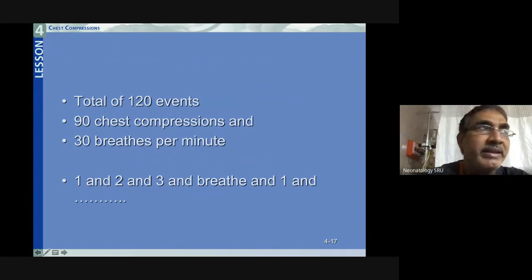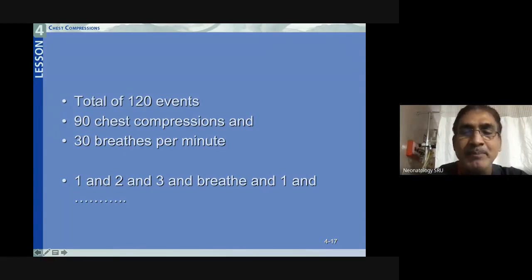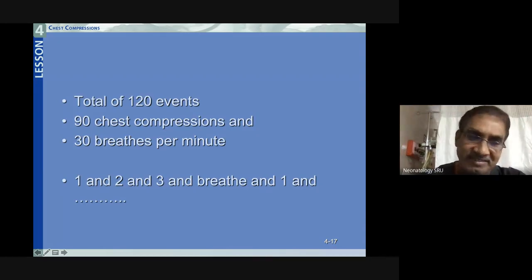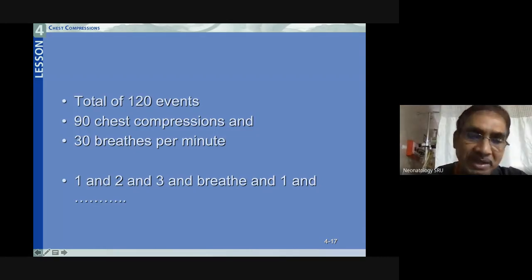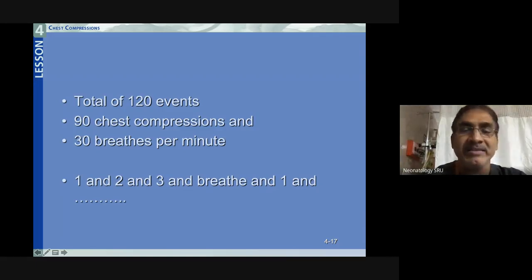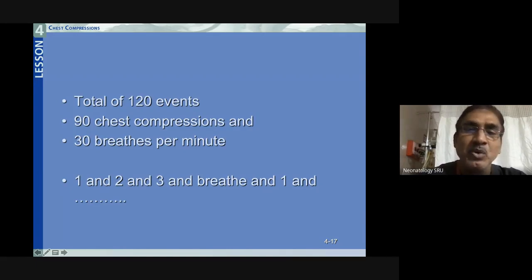The coordination rhythm: one is compression and relaxation, two is compression and relaxation, three is compression and relaxation, followed by breathe — at that point the person holding the bag gives a breath. Continue this as: one-and-two-and-three-and-breathe, repeating without interruption for approximately 60 seconds.